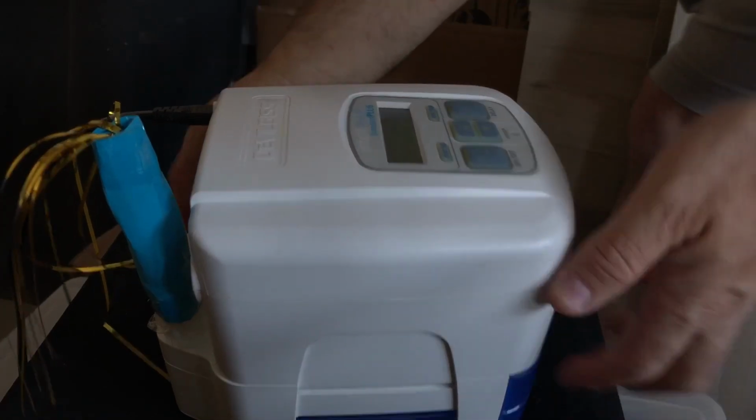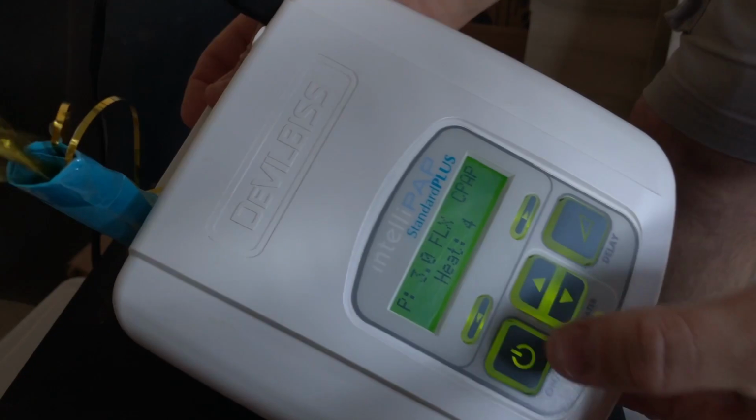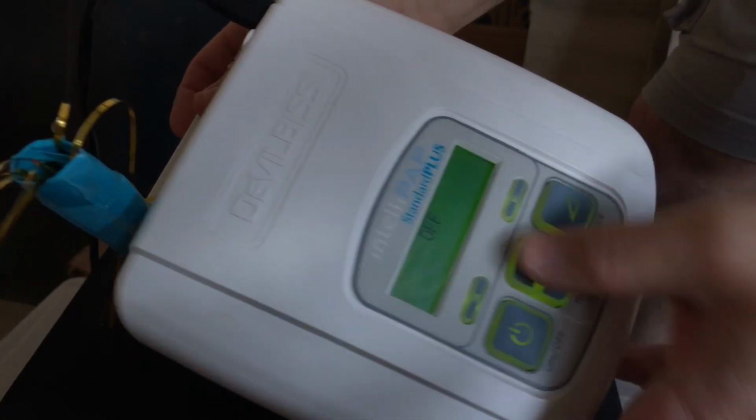Hey folks, this is an old CPAP machine. It's called DeVILBISS, as you can see there. I've got it plugged in, so you can see it works. You can see the fan blowing air there. And we have different options here. I'm going to turn it off for a second.